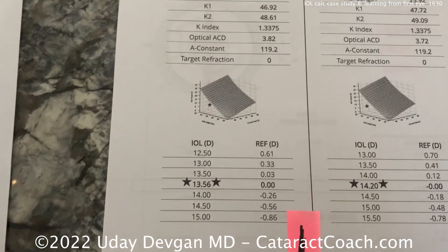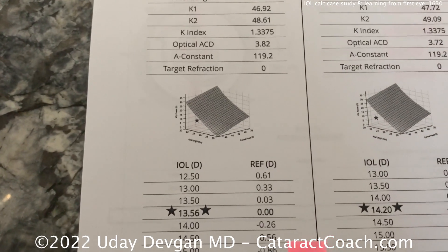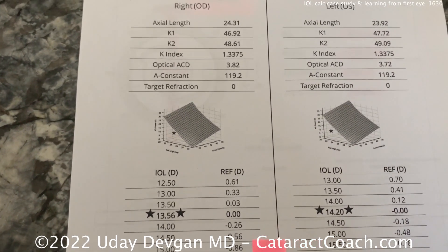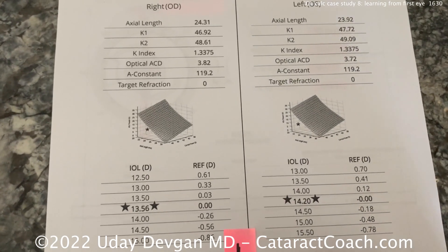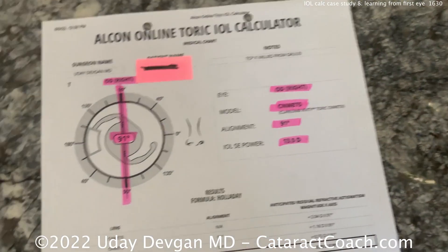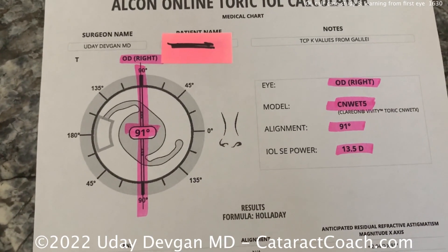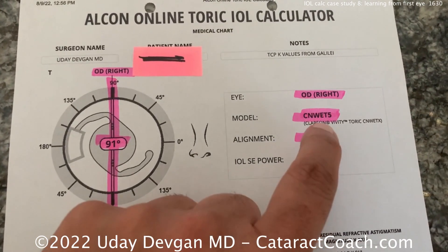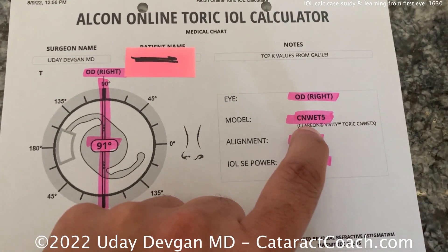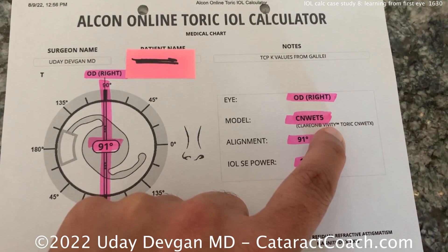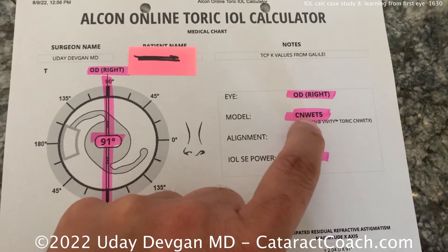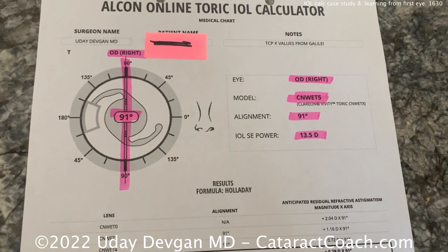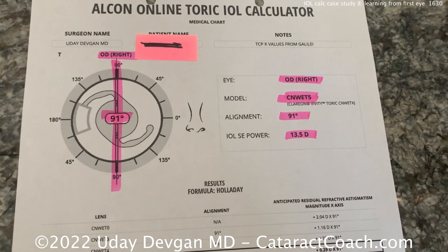Looking at the Ladas super formula, we get about 13.5. So I think that's a reasonable option. We'll make our surgical game plan — we're going to put in a 13.5. It is a toric extended depth of focus lens with two diopters of correction at the corneal plane. The alignment looks pretty good.